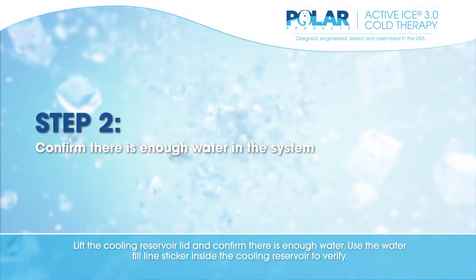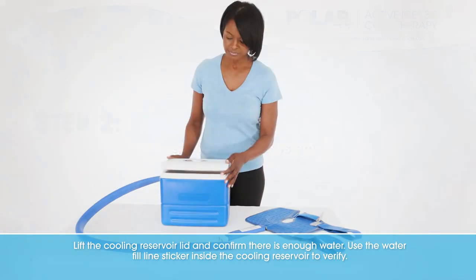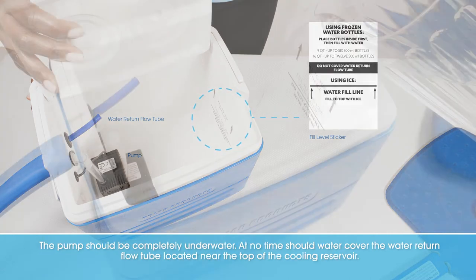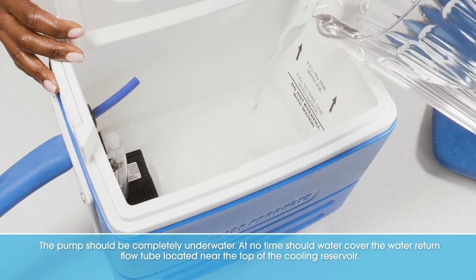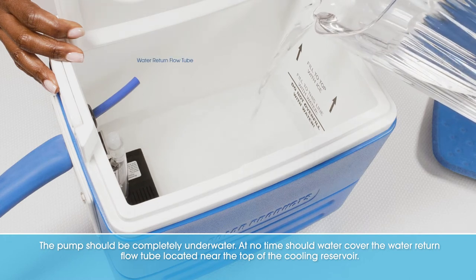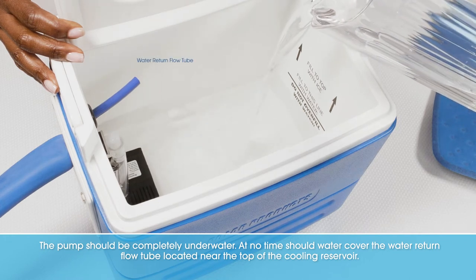Lift the cooling reservoir lid and confirm there is enough water. Use the water fill line sticker inside the cooling reservoir to verify. The pump should be completely underwater. At no time should water cover the water return flow tube located near the top of the cooling reservoir.